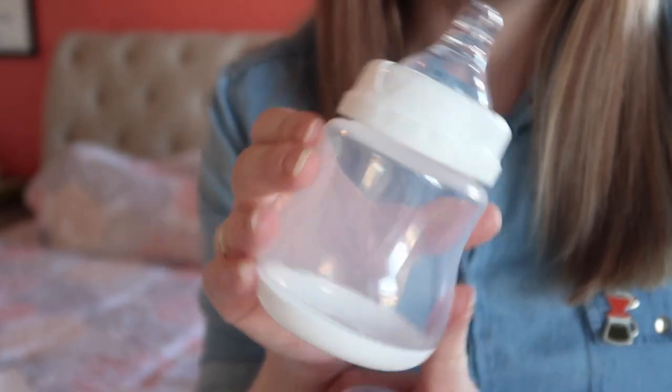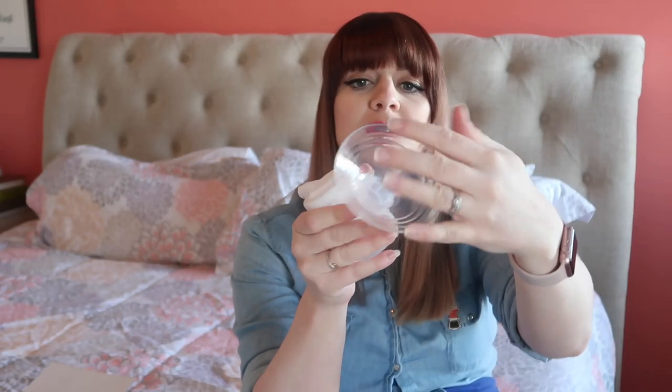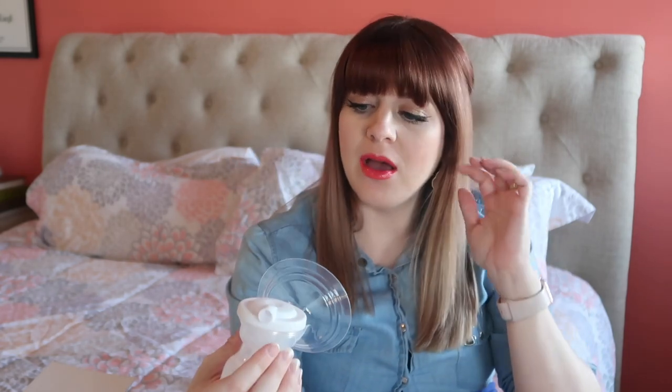So I wanted to do a little bit of an unboxing. I really like the bottles that come with this — they look super big to me, bigger than my Medela ones, and they're silicone which I like. That looks like it would be really comfortable to pump with.